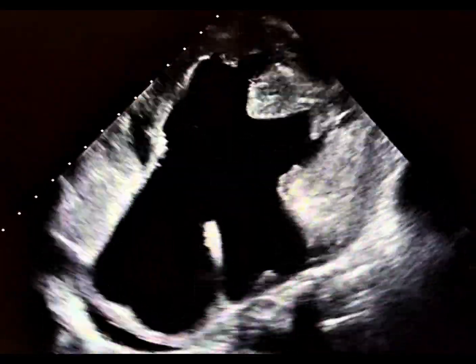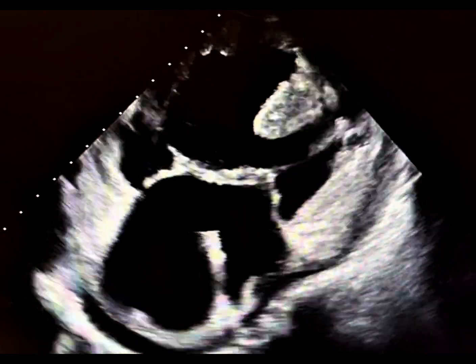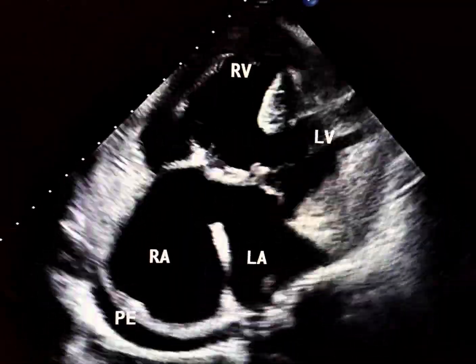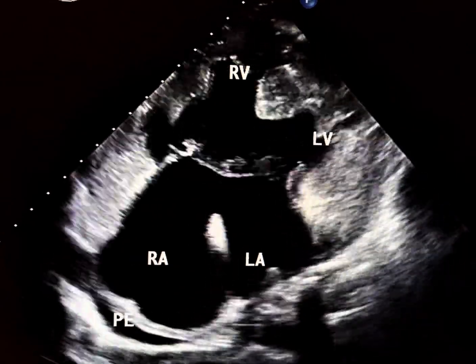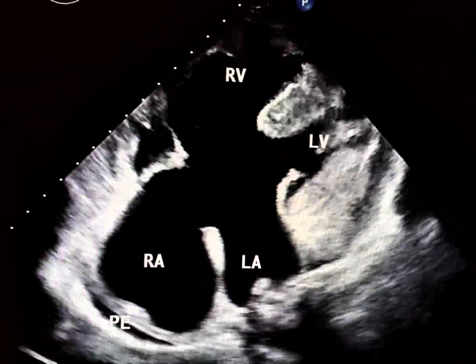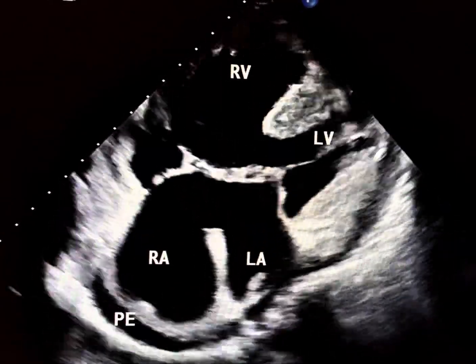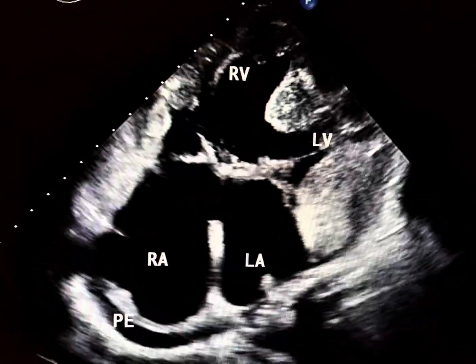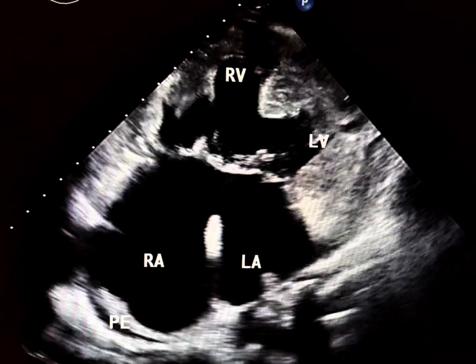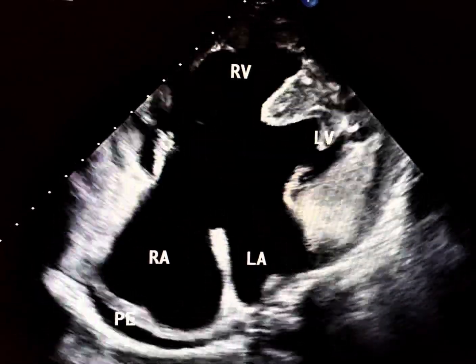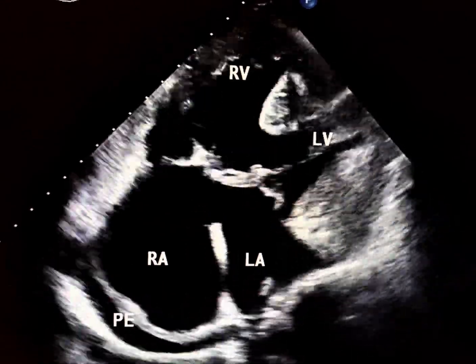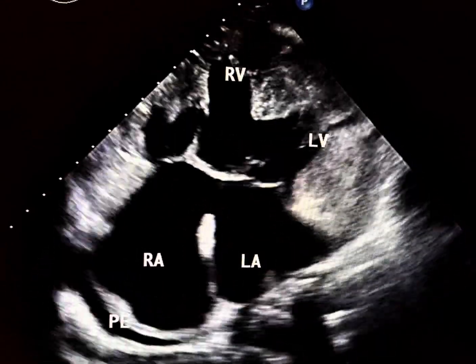Take a look at this echocardiogram of a middle-aged woman with severe pulmonary hypertension. It shows a large ostium primum atrial septal defect (ASD), a large inlet ventricular septal defect (VSD), and a single atrioventricular valve instead of separate mitral and tricuspid valves. It is an atrioventricular septal defect (AVSD), also known as a common AV canal.